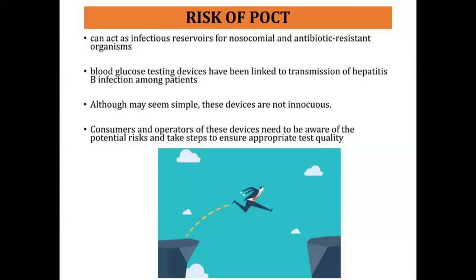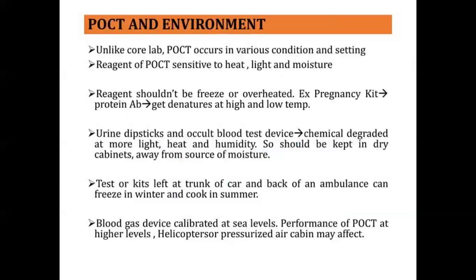People should not panic about the readings and jump directly to some conclusion. One more problem with the risk is that there should not be any cross contamination. Suppose you are taking infected blood and putting it onto a device, that may be infectious to other people also. So that should be taken care of. And what environment you're using it in also matters.